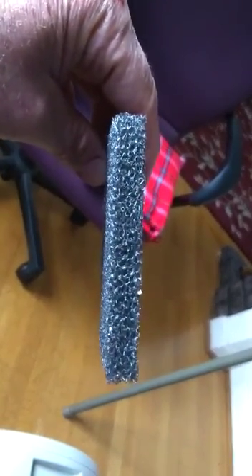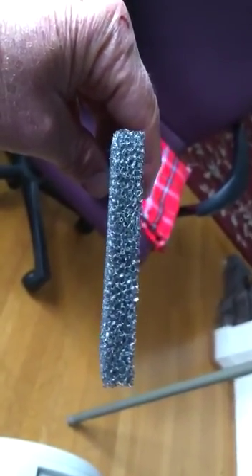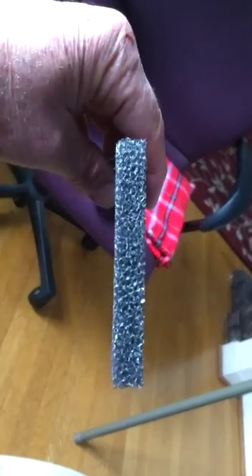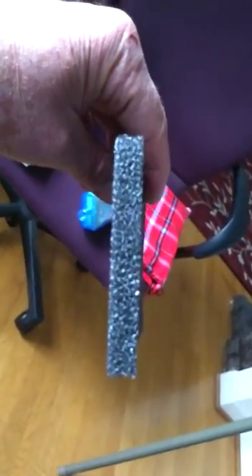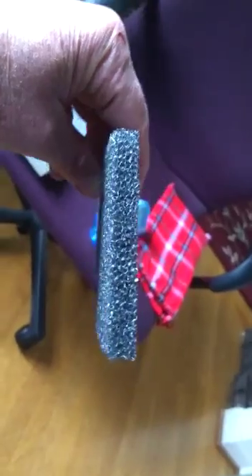The thicker 2.5 centimeter sheets that we had you test are 30 pores per inch or 12 pores per centimeter. Much smaller holes, and they are expected to have much more resistance and be able to capture a lot more particulates before you get to the HEPA filter itself. Why is that important? Well, let's look at the HEPA filter.